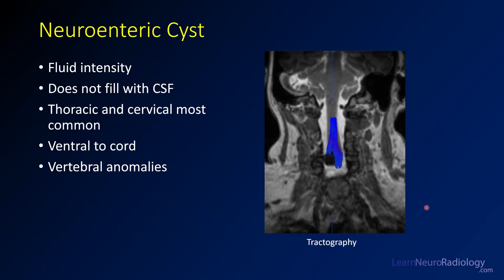This is a neuroenteric cyst. Neuroenteric cysts are fluid-intensity lesions that occur within the neuroaxis. They are not filled with CSF and should not communicate with CSF. The most common locations are anterior to the brainstem or in the ventral components of the thoracic and cervical spine. They are often associated with vertebral anomalies. Superimposed tractography from this patient shows how the spinal cord fibers are displaced and splayed apart by this extra-axial lesion.